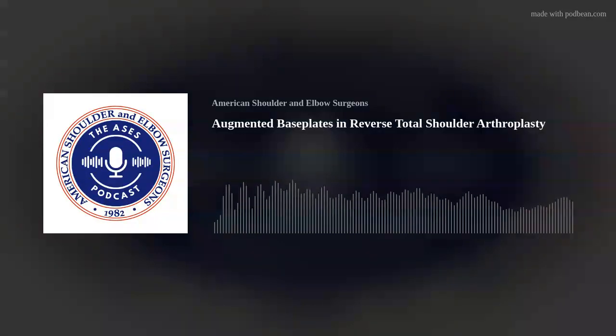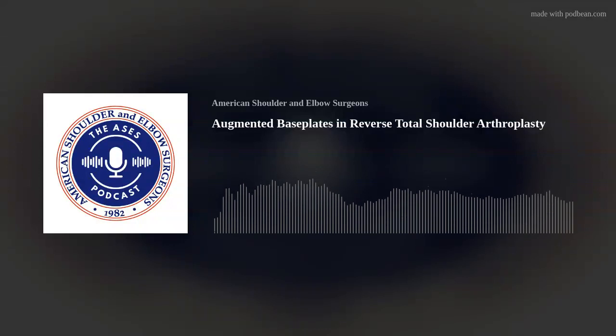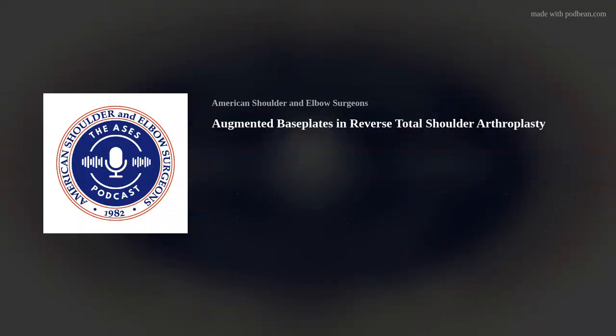I do agree with Joe. I want to try and minimize 2 surgeries, but I've unfortunately done this like Joe long enough that I've had failures of one stage, and I really just want them the best chance to have a long-term success. I really do worry about ingrowth on these base plates, even though initial fixation can be good. Ingrowth can be tough in this sort of sclerotic bone.